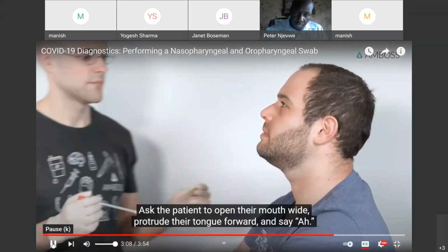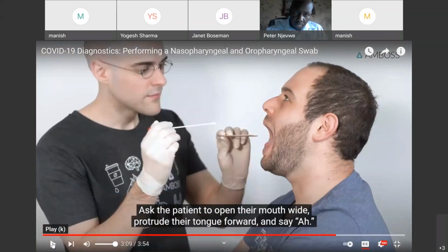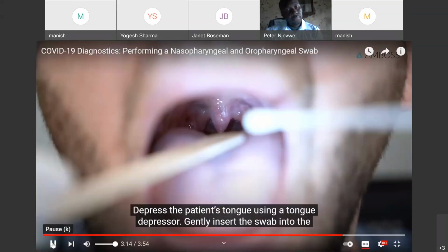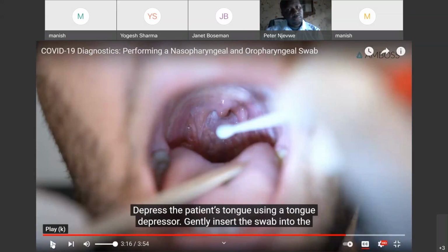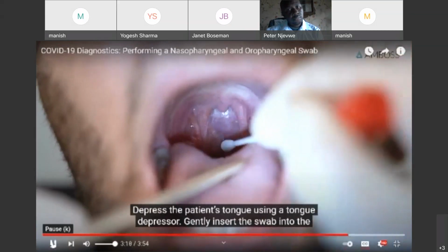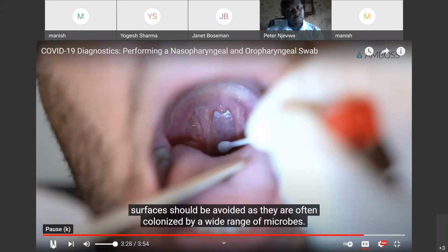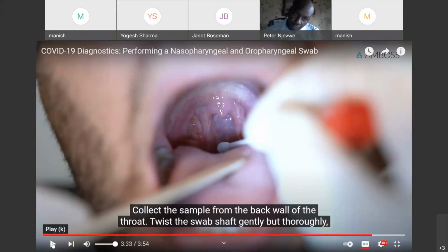Ask the patient to open their mouth wide. We have to depress the patient's tongue using the tongue depressor and gently insert the swab in the oral cavity without touching the lips, teeth, tongue, or hard palate. These surfaces should be avoided. They can be colonized by a wide range of microbes, because the teeth and tongue would have different kinds of microorganisms.